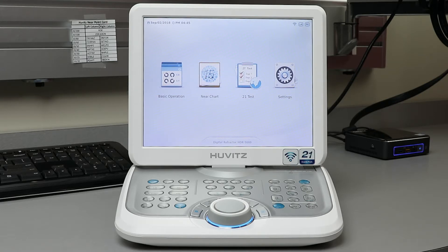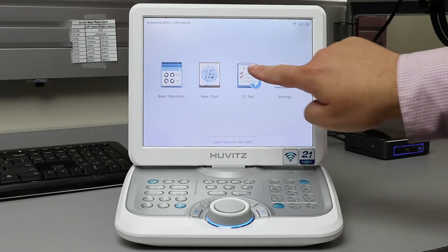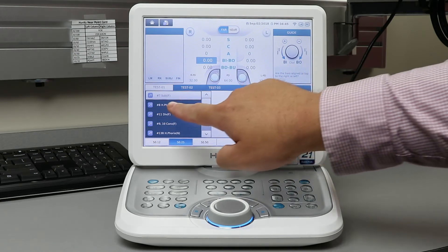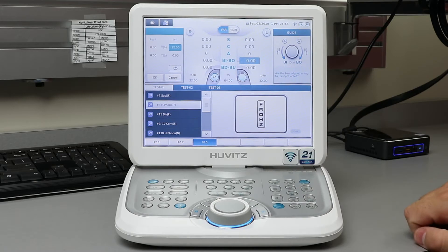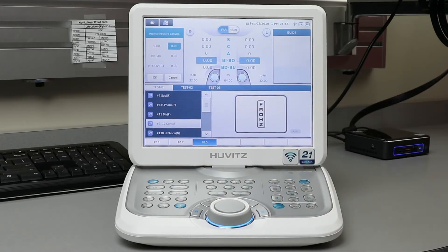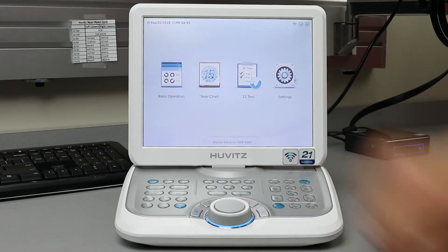Here at the home menu you will see the 21 test icon. Press this icon to pull up 21 of your standard charts. This will allow you to quickly complete a full examination. Press the home icon to return back to the main menu.